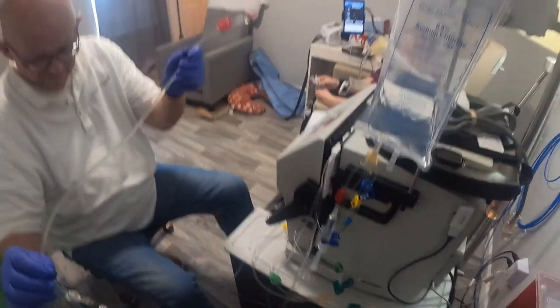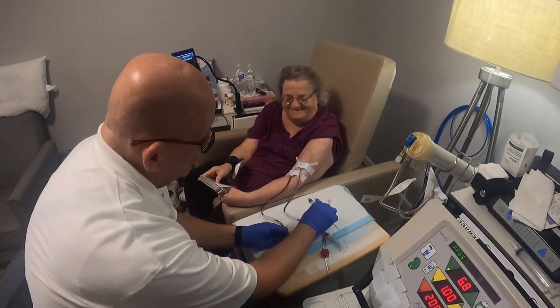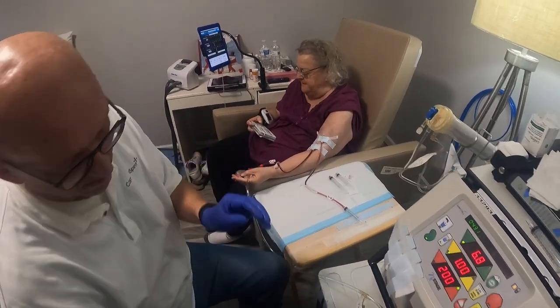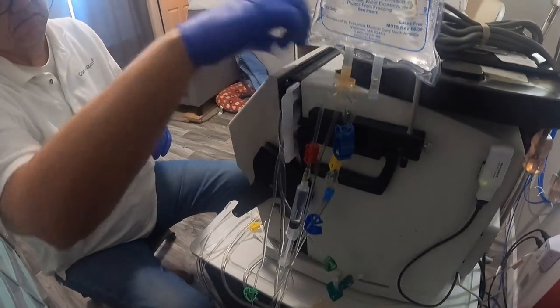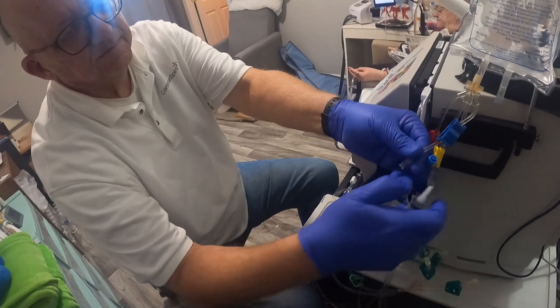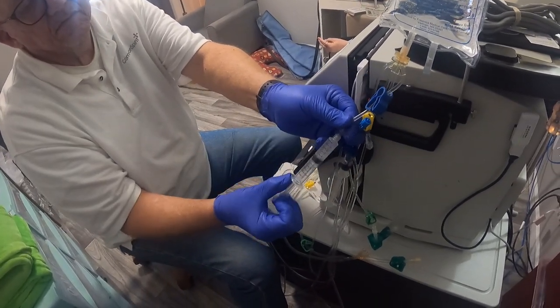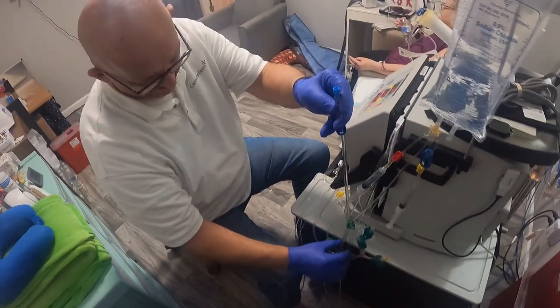Connect the red line to the patient's arterial. And clamp. Okay. Clamp both clamps on the blue line under the saline bag. It was a little tangled up. Disconnect and attach a clean 10 ml syringe. I noticed that too when I was doing the snap and tap, but I'm not as good at fixing it as you were. Wire management, right, Deb? Mm-hmm.